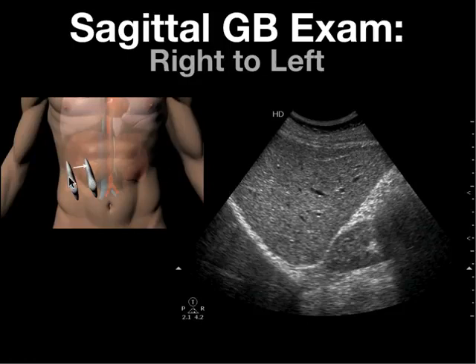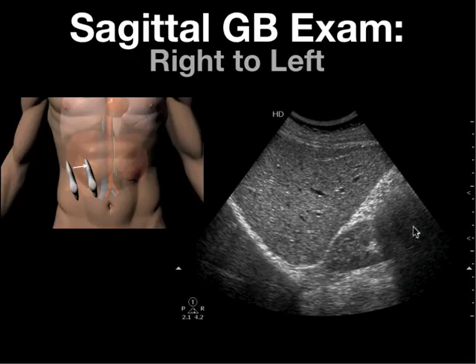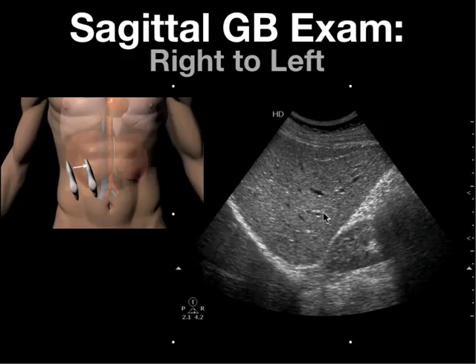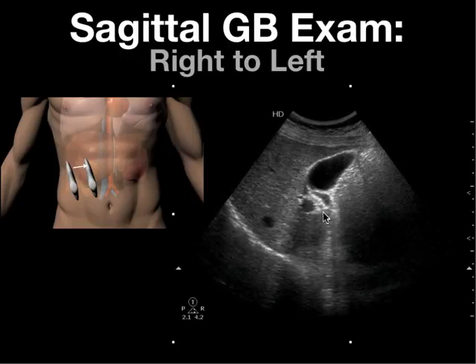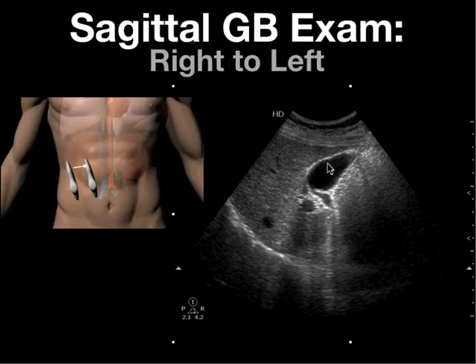Here's an example of the right upper quadrant sagittal window going from lateral to medial. We start off seeing the liver — anterior, posterior, head and foot. Here's the diaphragm, the right pleural space, and the kidney. As we move the transducer medially, we bring the gallbladder into view. Here you can see the fundus of the gallbladder, and here you can see its neck.